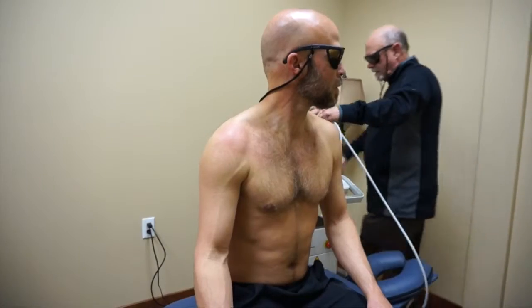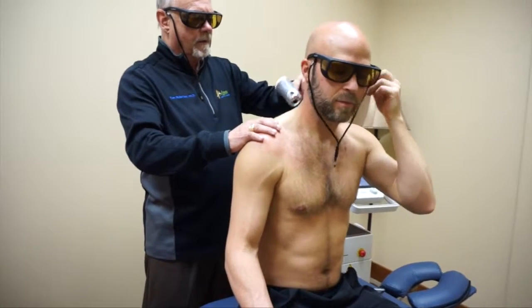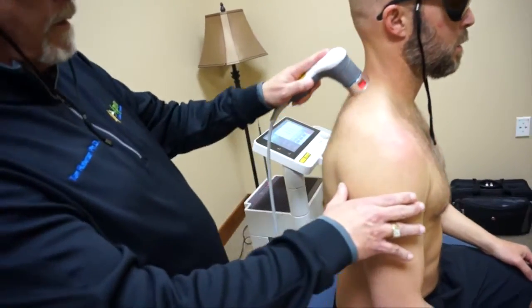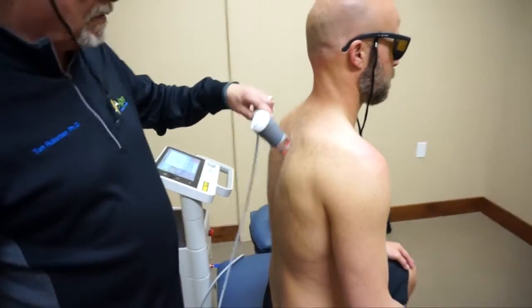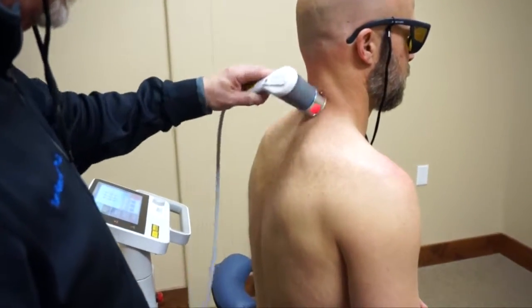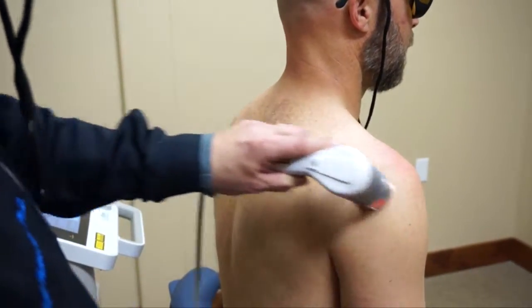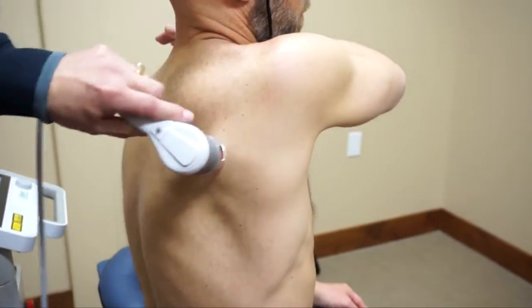You're more in tune to your body than a regular patient. I would treat all three areas. I'm going to go over here — do you want me to put it over there? And if you really want to be creative, you could slide it along the border here using this. I think these areas are going to show some involvement. Is that where you feel the sensation starting? Yeah.